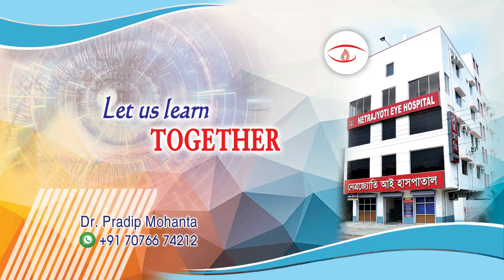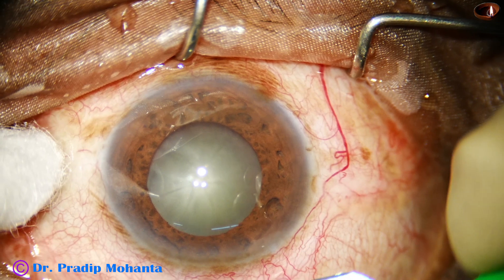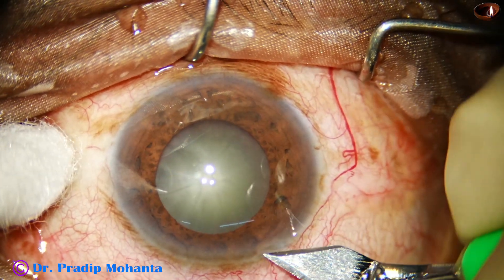Friends, in this video we are going to explore the possibilities of B-Octa pupil expansion device. This patient had IFIS in the other eye. We used B-Hex. In this eye, we are going to use B-Octa.